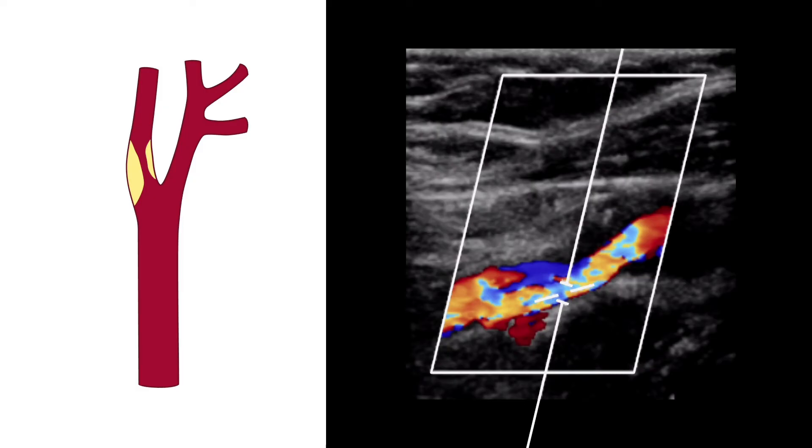A tight stenosis or high velocity jet just beyond a stenosis may also cause aliasing to occur in the color flow image. The marked changes from reds to blue associated with aliasing will make tight stenosis easy to identify.